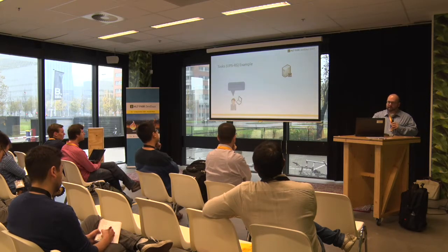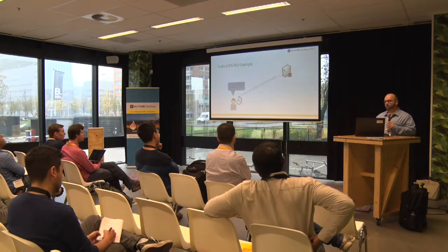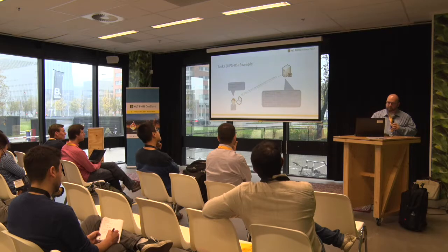If you want to build out tasks and workflow, I use UPS-RS, which is basically I can say I would like to query items on a work list. So here I would say, give me all the items for Dr. Brad for me to read today.